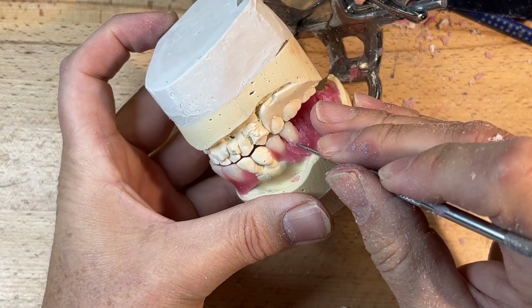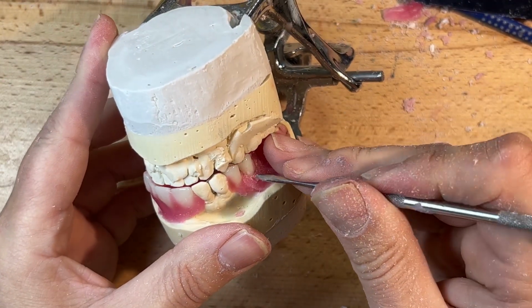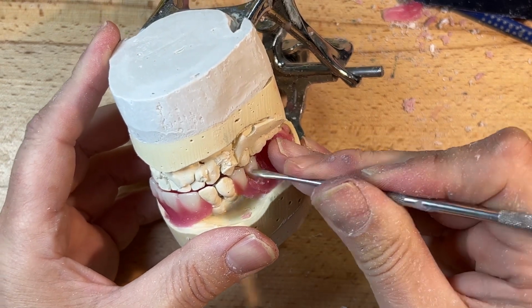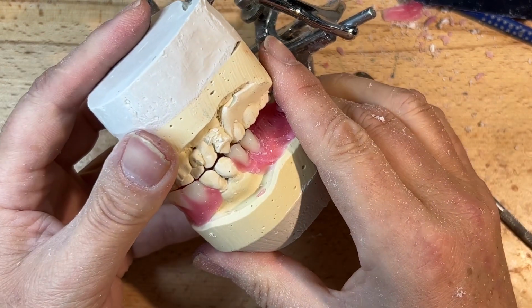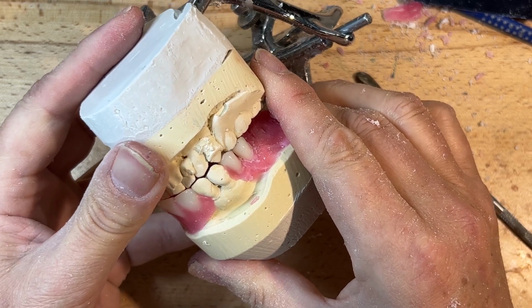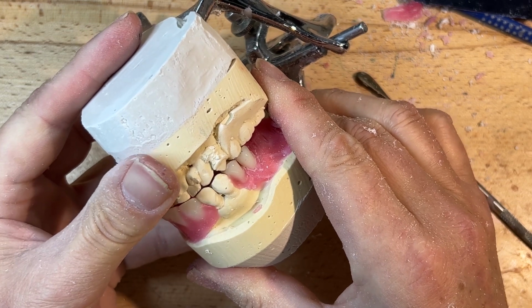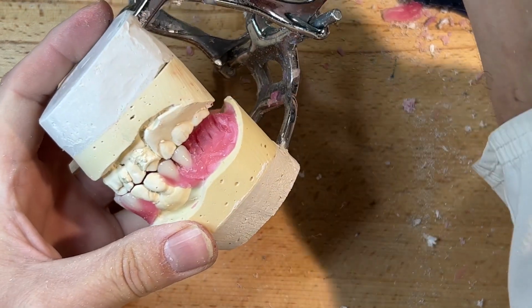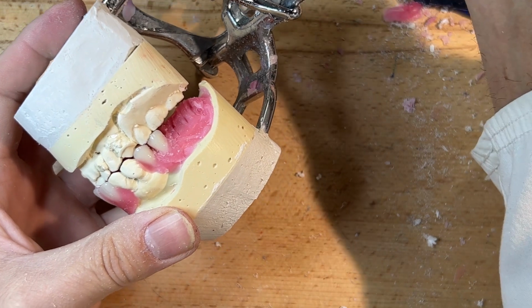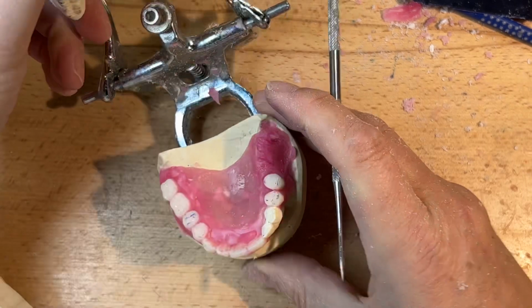Prematurely age the denture teeth. But we need to maximize this centric occlusal contact and smooth emergence angles. Smooth lateral excursions, smooth lateral excursions without any eccentric contacts. No hyperocclusion to reduce the stability of this maxillary denture.